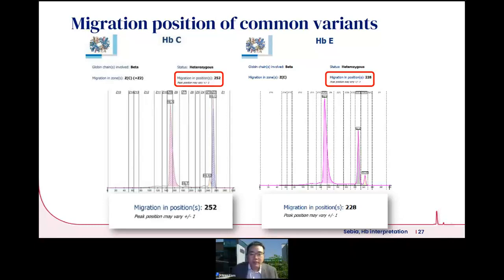So likewise, for hemoglobin C and hemoglobin E, if you place your cursor at the top of the peak, you will see a position of 252 for hemoglobin C and 228 for hemoglobin E. Of course, remember that for hemoglobin E variants, the variant peak is much lesser in percentage compared to the other common variants because the hemoglobin E variant has an expressional change, and therefore it resembles a thalassaemic presentation to some extent. And of course, an increased hemoglobin A2 as well.